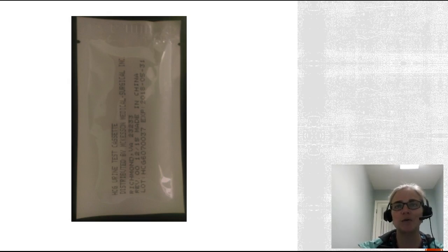As of right now, I will be performing all those, but if you happen to open one and do it, you can come find me and I'll help you do it. Really what we're doing is running a basic test where we put in a solution that gives us a positive result and a negative result, and then we would know that that lot is capable of giving good results. So that's what that is. It's really important to record the lot number and expiration date, just in case we ever had any trouble. We could come back and look at it. And I'll show you the logbook in just a second.